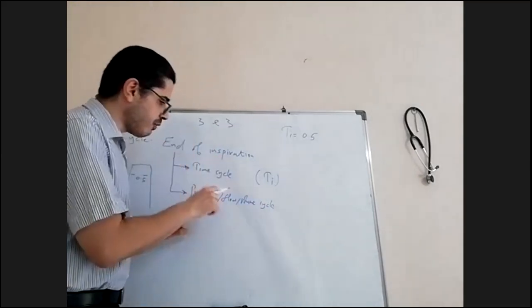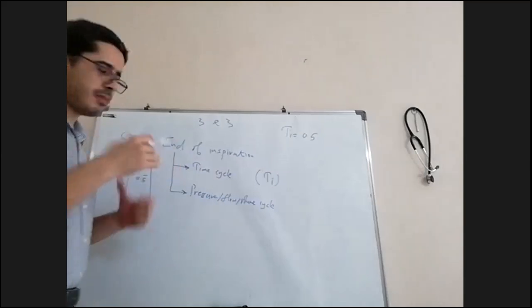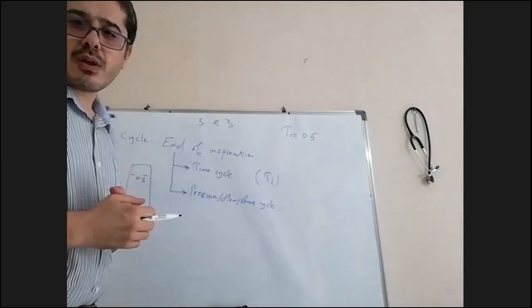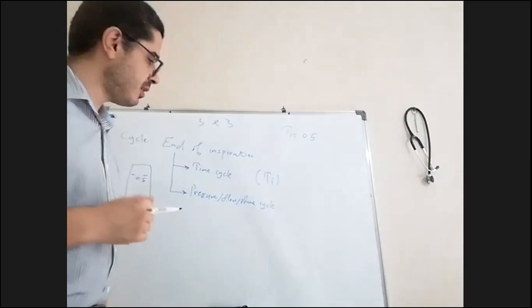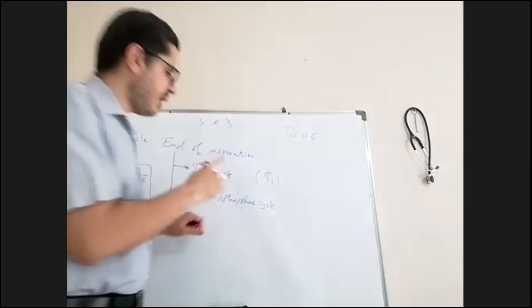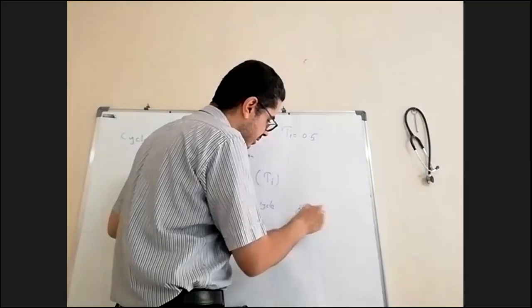So this pressure, flow, volume cycle has no TI. It is not related to TI. When the patient achieves a certain amount of flow or volume or pressure, then the patient will cycle into expiration. This is usually patient effort and can be modified by the machine by using ETS. We will talk about it later.